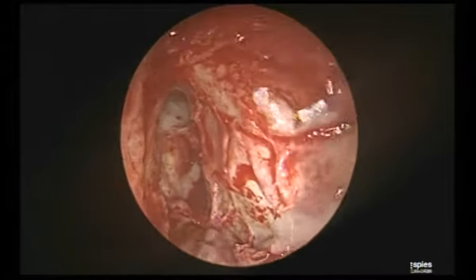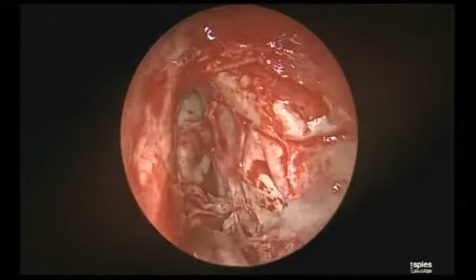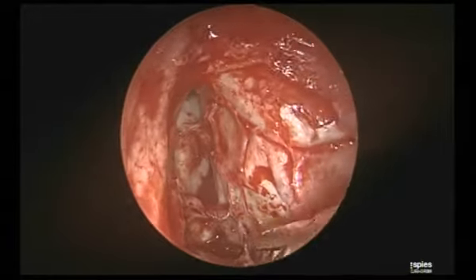And you are with a 60 or a 120 still? 60, yeah. Now see the better picture of the anterior ethmoidal as well as the lamina papyracea. Yes, very nice.